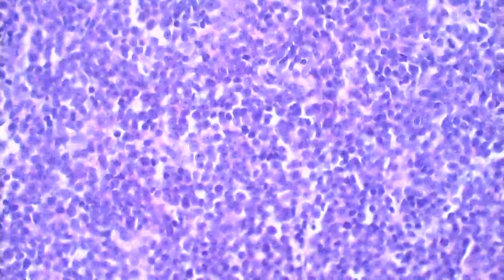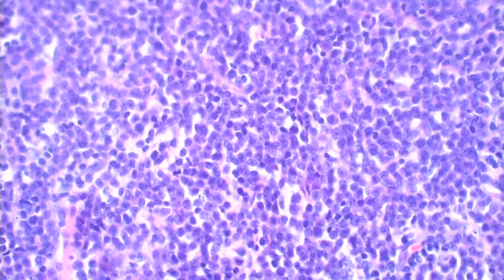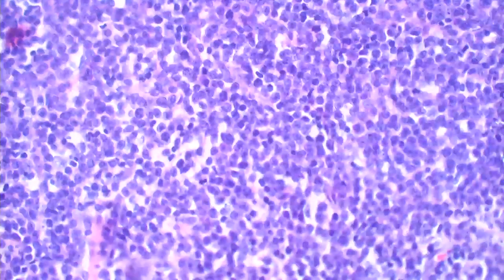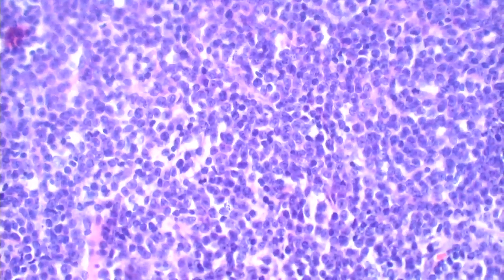Could it possibly be a pseudo-lymphoma? What do you think? Think it might be benign? No. Was that a yes or a no? No. A no, good, because it's not benign. It's sheets of these atypical cells.